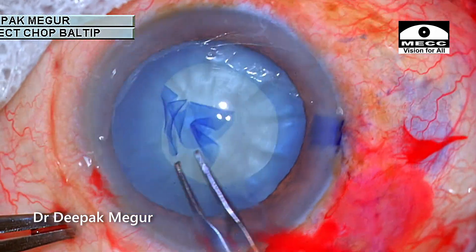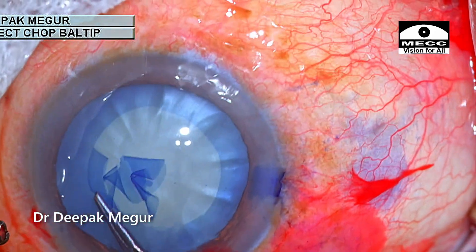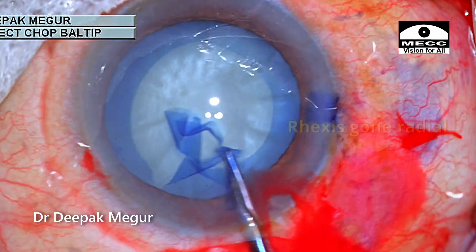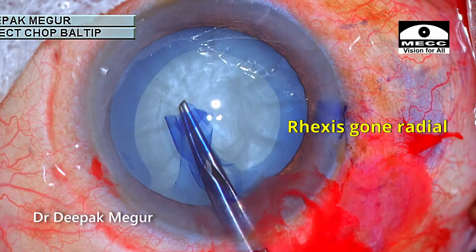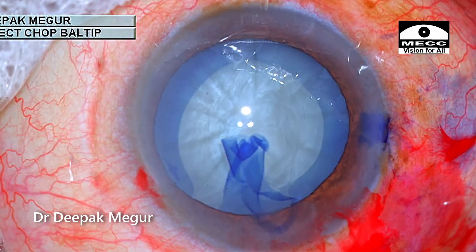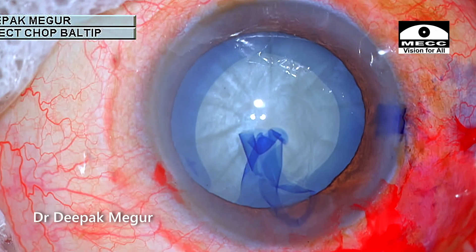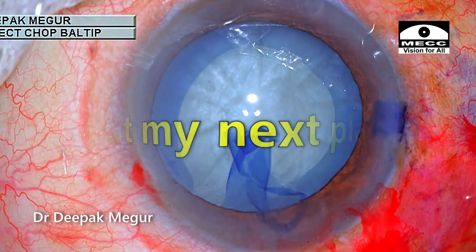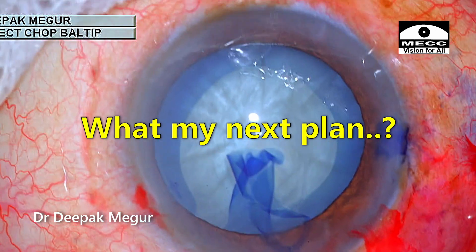It seems to be going well, but just before completion, a complication occurs. It was quite disappointing. In hindsight, I became a bit too greedy. I will analyze this incident at the end in the summary section. The rhexis is not continuous.